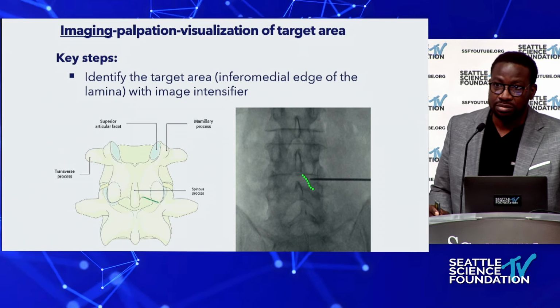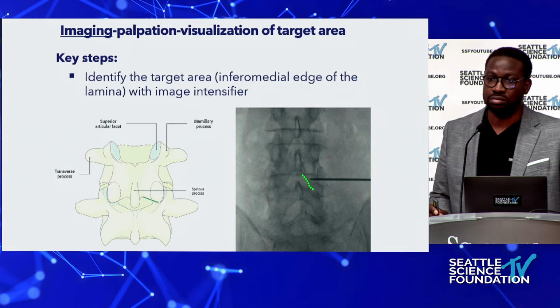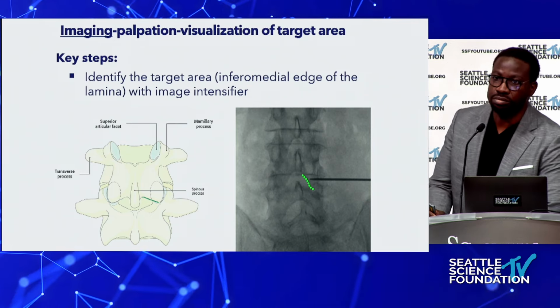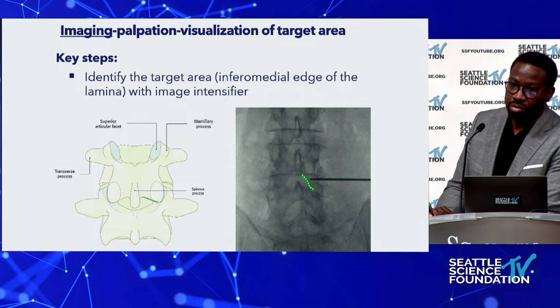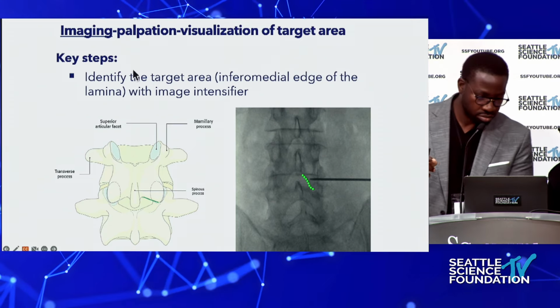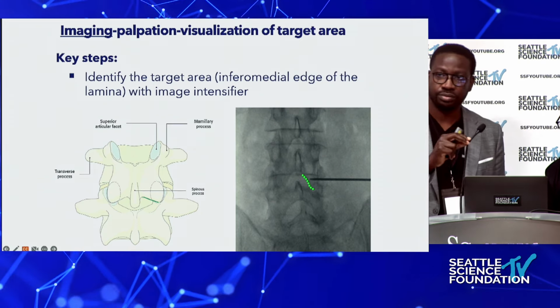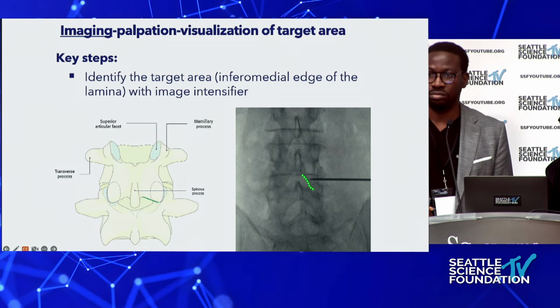What's the faculty's experience with doing transforaminal approaches in scoliosis patients? We see a lot of these patients who have isolated radiculopathies either on the convexity or the concavity of the scoliosis, and often that open foraminotomy leads to a scoliosis revision at some point down the line. So is a foraminoplasty a viable option instead of doing the multi-level TLIF or whatever?